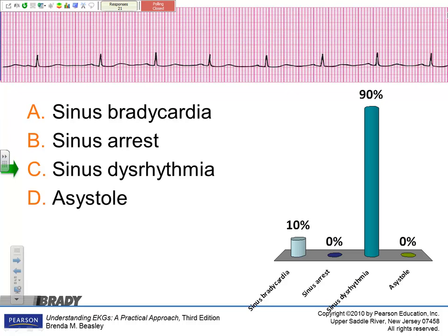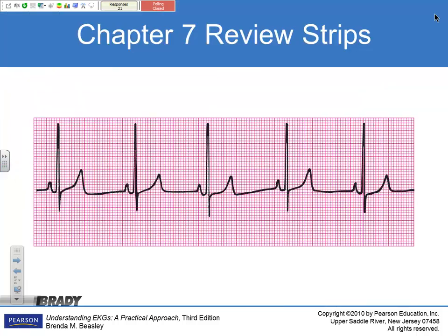Yeah, this is too close. I'd have to call that sinus rhythm. I was looking, I'm going, where's the normal sinus rhythm? The first one is longer than any other, and then I guess the fourth one's long. Yeah, it's pretty close though, isn't it? If you just look at it, I guess if you measure it out, you might call it dysrhythmia. Yeah, that's what I called it, because you've got a little bit of variation, but maybe that first complex between the first two is it.